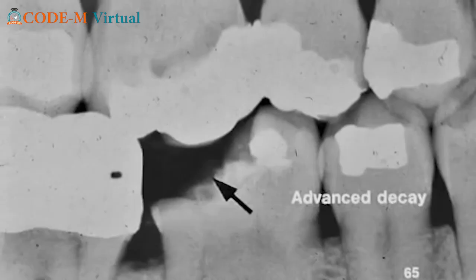So this is another X-ray, and this is tooth number 30, showing some decay, and we can see that more than half of that tooth is exposed to caries, so the dentin is damaged halfway. This can obviously be a carious lesion, or we can say that it's an advanced decay.